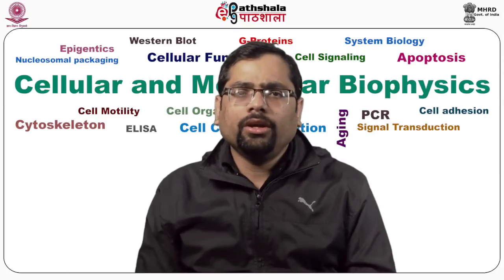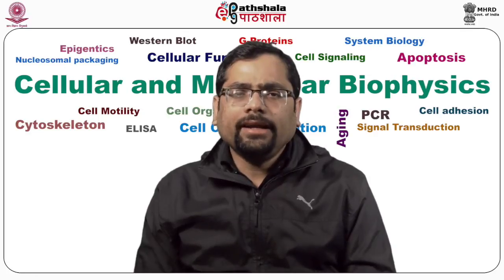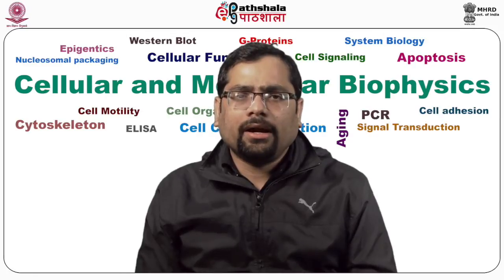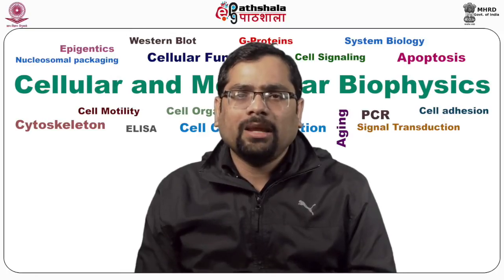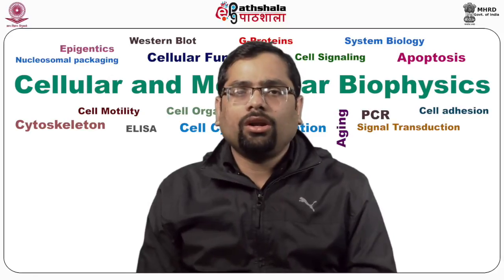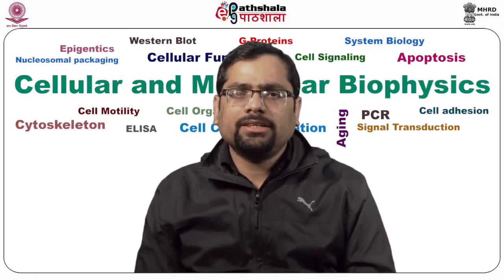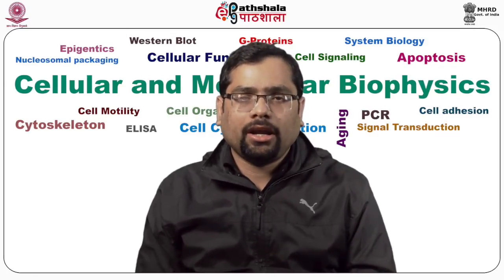In addition to hemoglobin, there are some other chromophores also, which include cytochrome C oxidase. It can also be assessed using this technique of optical differences. Cytochrome C oxidase, a marker of metabolic demands, holds the potential to provide more direct information about neuronal activity than hemoglobin. But cytochrome C oxidase is not used as extensively as oxyhemoglobin or deoxyhemoglobin, but it can be used since it is a marker of metabolic demands. So, it has the potential to provide more direct information than hemoglobin about the neuronal activity in the brain or any other tissues.